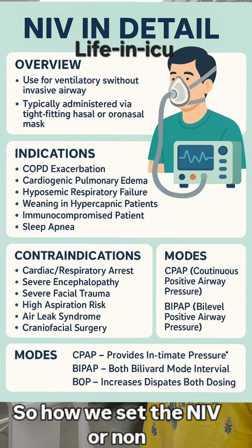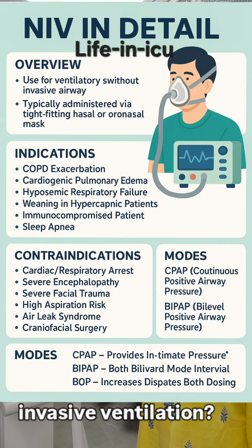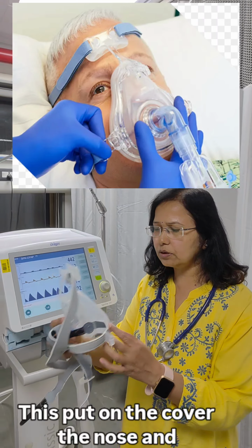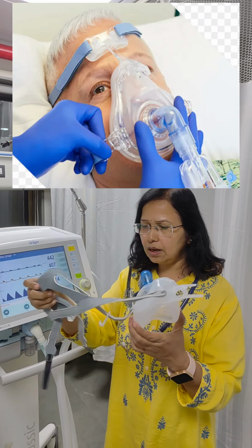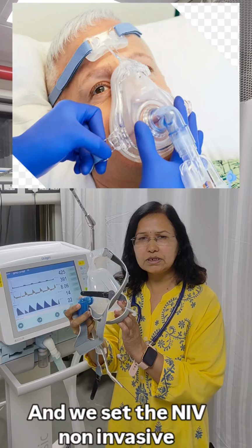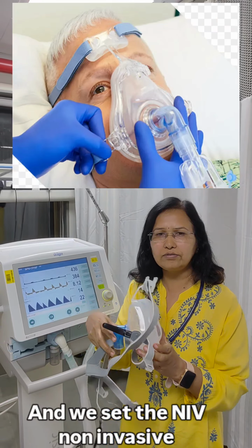So how do we set the NIV, or non-invasive ventilation? We provide this mask. This is the NIV mask. It is put on to cover the nose and mouth, and these are the braces. Through this we cover the patient's nose and mouth, and we set the NIV, the non-invasive ventilator.